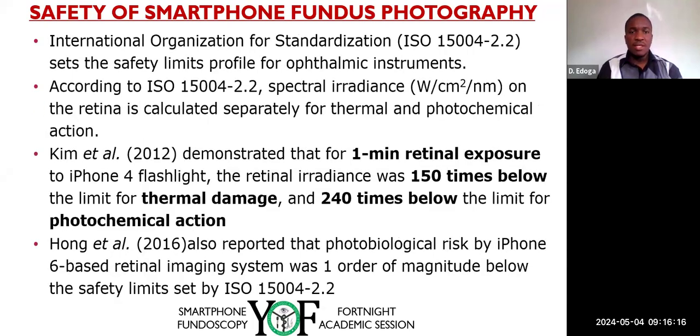Then in terms of the International Organization for Standardization, ISO, it has ISO 15004-2.2, which tries to set the safety limits for irradiance from ophthalmic equipment.